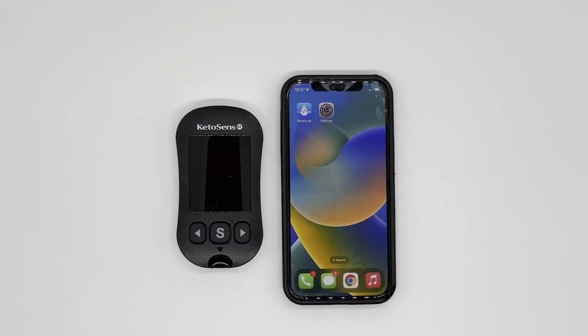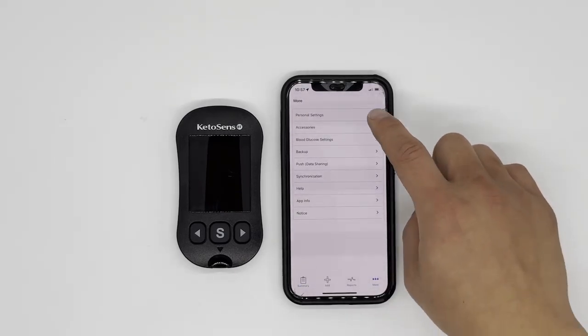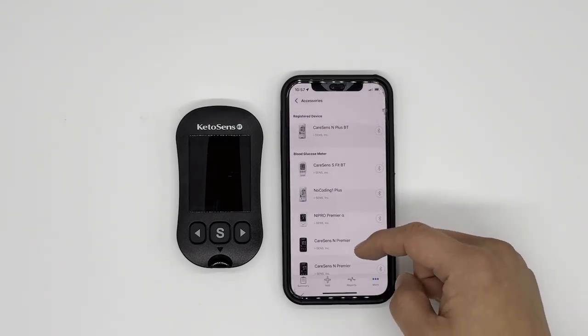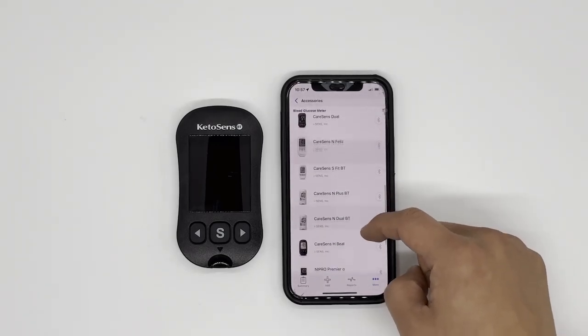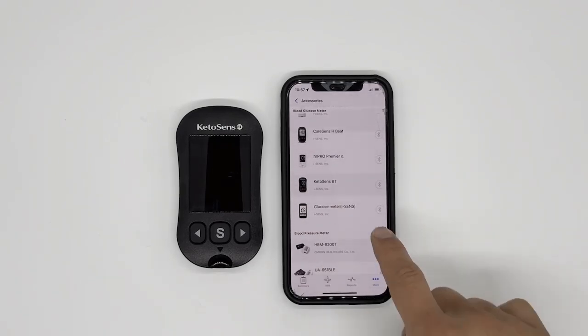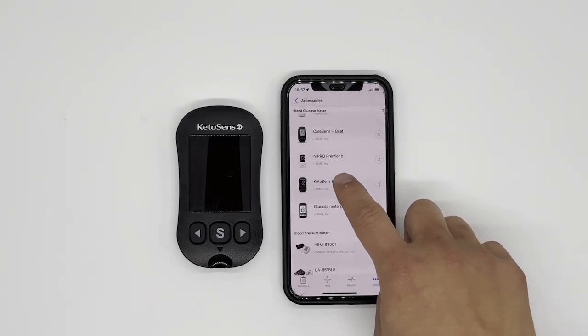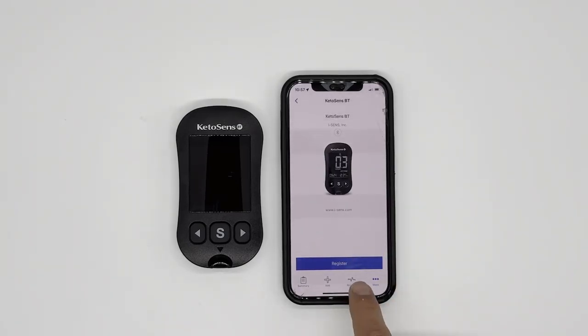Now that we've done all of those steps, we can go into the official steps. Let's go to SmartLog — bottom right, 'More,' then go to 'Accessories.' Scroll down to find KetoSense BT. If you do not see KetoSense BT, you can update your app, or you can also choose 'Glucose Meter (iSense).' For now, I will use KetoSense BT. Click that, then click 'Register.'